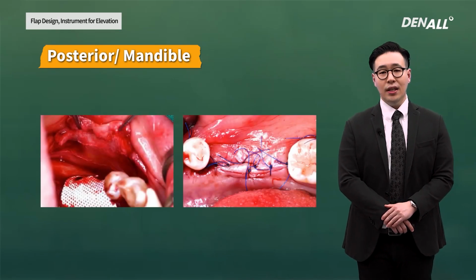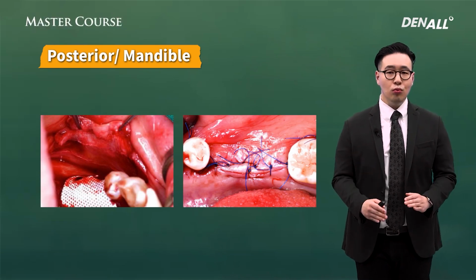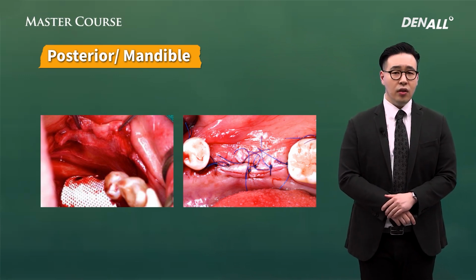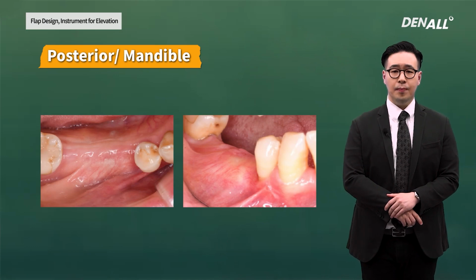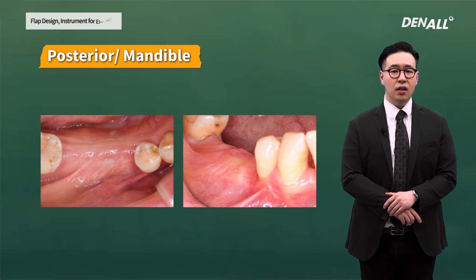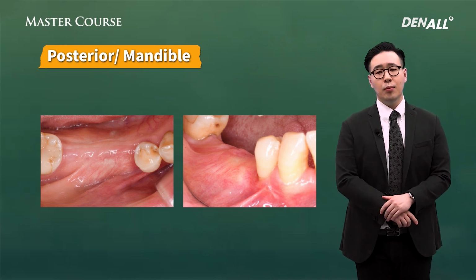and suture was done. Two vertical incisions were used, so the surgical site was limited, but at the same time, sufficient visibility and accessibility was secured. In addition, because I did a vertical incision, I was able to do the releasing incision more easily. This is a very important point in the success of vertical augmentation and early healing. After 6 months, this is right before secondary surgery. Accurate flap design and flawless flap elevation and retraction can affect post-op healing, and this case really shows that point.